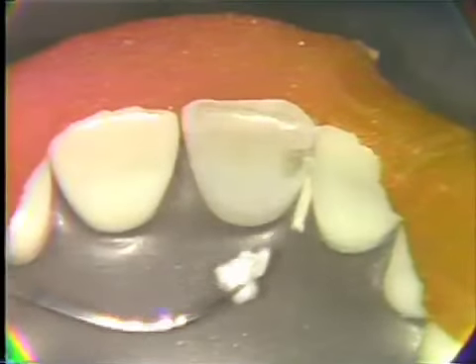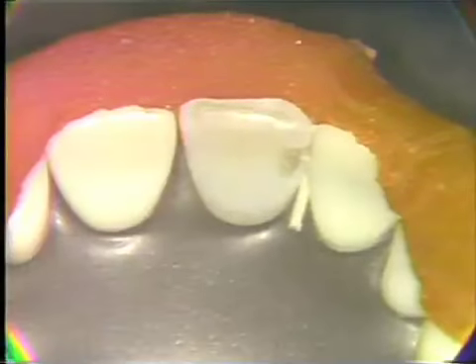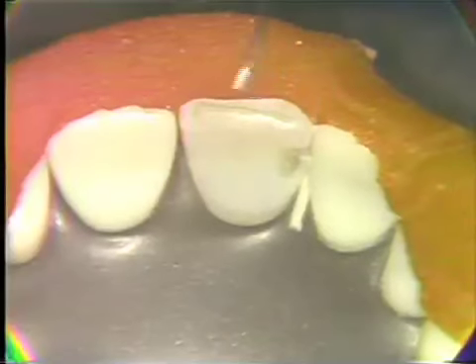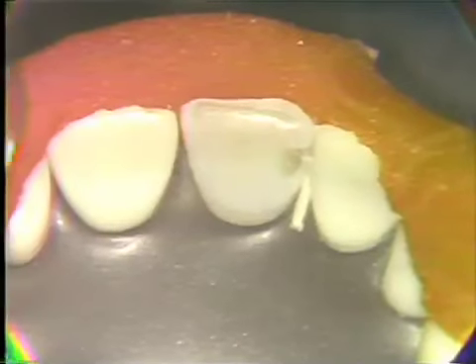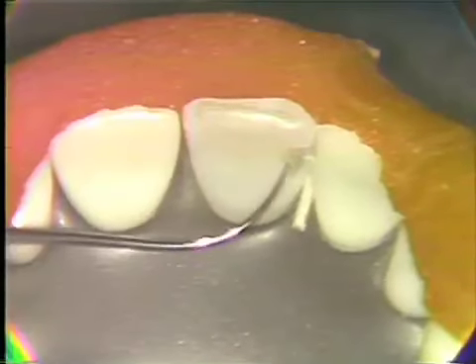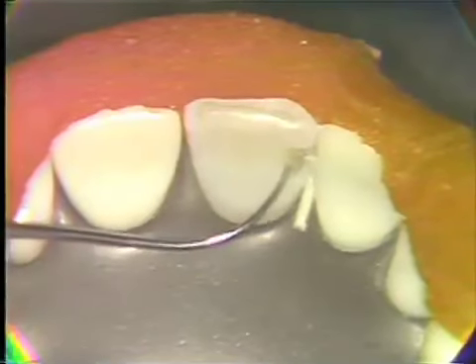We're removing the temporary stopping from the prepared cavity. We've placed this into the prepared cavity first and then have applied an acrylic matrix across the labial aspect of these teeth. Doing this in order to create a wall against which we can then condense the restorative material.